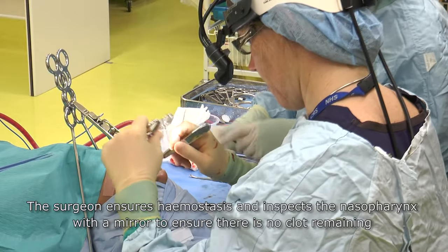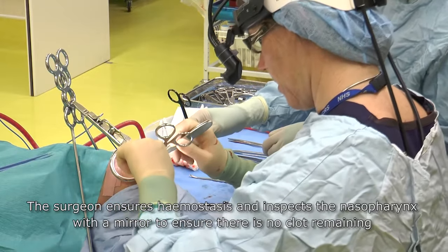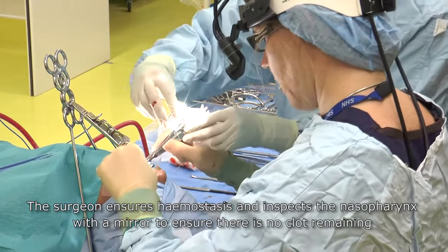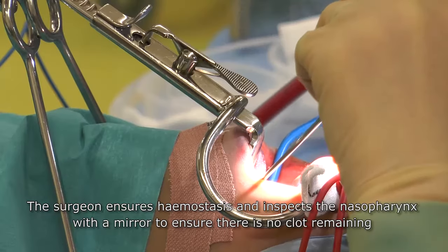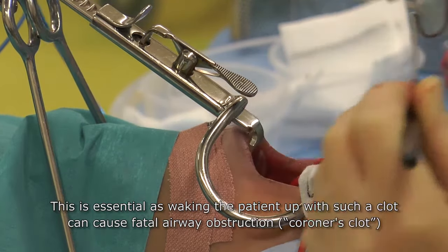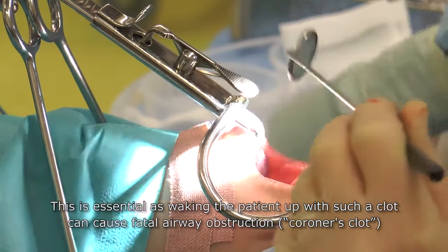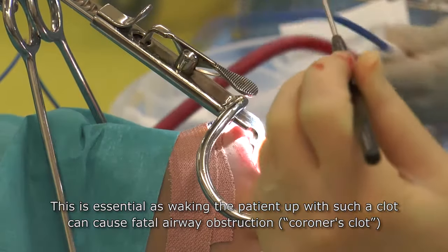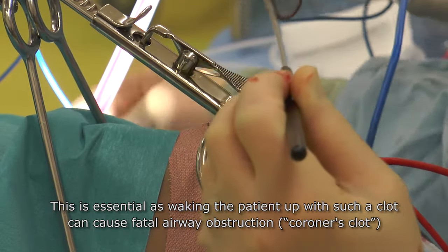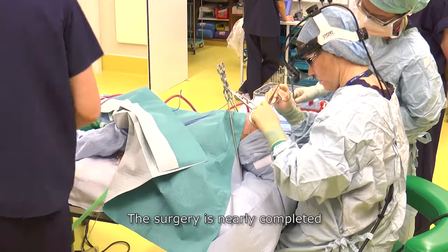The surgeon ensures haemostasis and inspects the nasopharynx with a mirror to ensure there is no clot remaining. This is essential, as waking the patient with such a clot can cause fatal airway obstruction. The surgery is nearly completed.